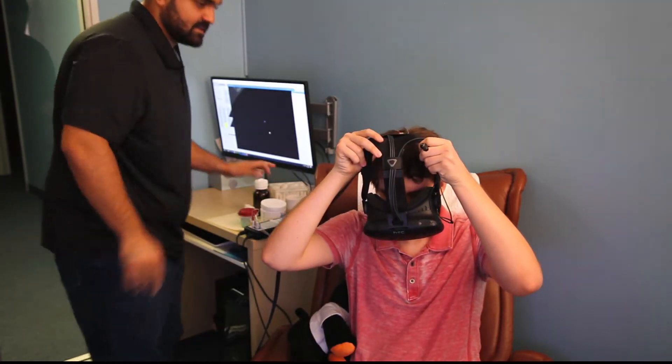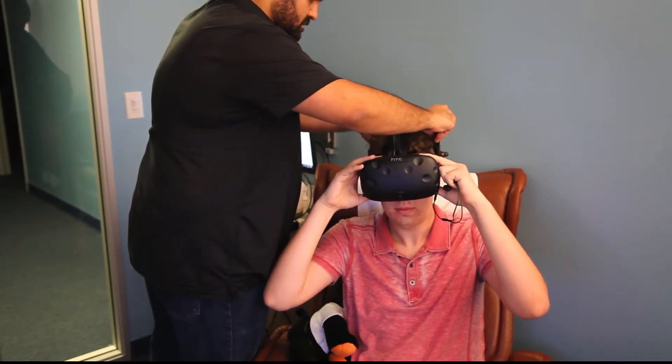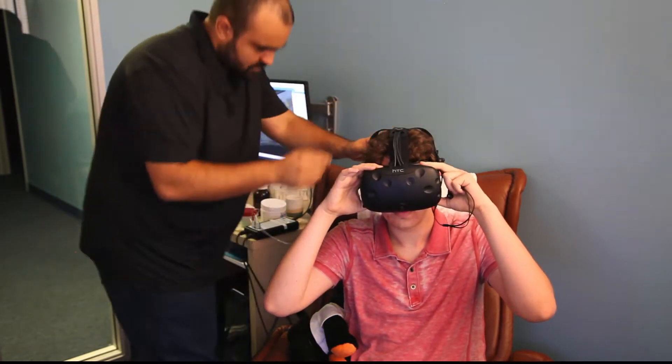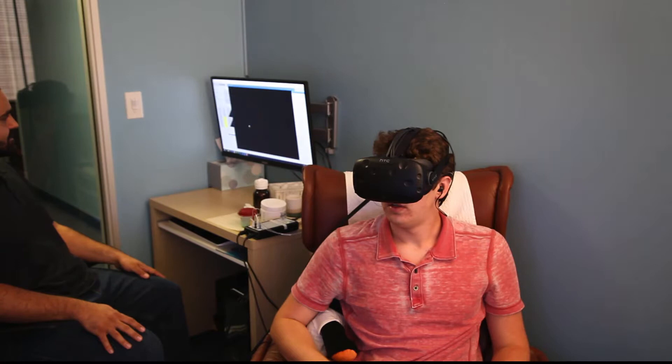You know how that's done, so I sped that up a little bit. And now here we are putting on the headset. You see him applying that on Griffin here, carefully putting the headset on. Then he puts the headphones in — you can also plug in different headphones. There's a little plug, so you can plug in any kinds of headset. They're using the earbuds right now.